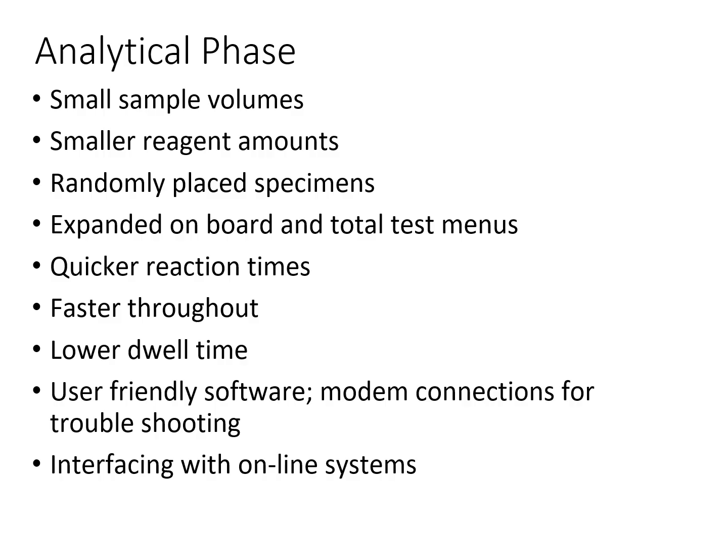There is user-friendly software for the most part. It is an intuitive interface that can help make operations simpler and help reduce errors. We can also have modem connections for troubleshooting. So sometimes if you're having issues, you can have some remote access capabilities with the manufacturer, which can help alleviate some issues that we're having immediately instead of having to wait a day or two for them to be able to come. Integration with online systems, so it facilitates the data exchange in connection with the lab information system or the LIS.